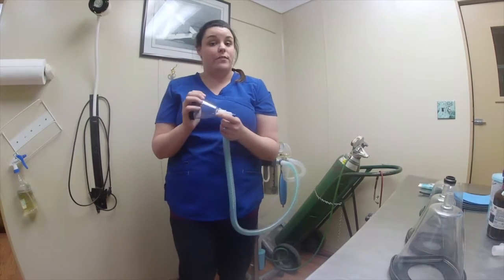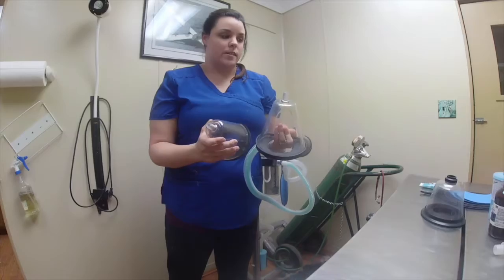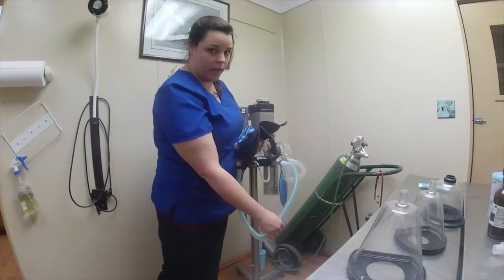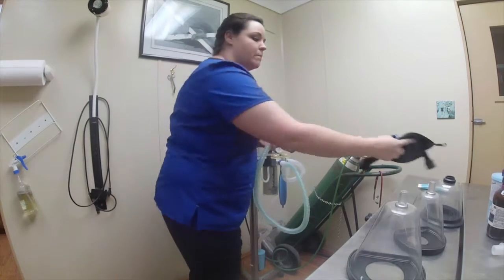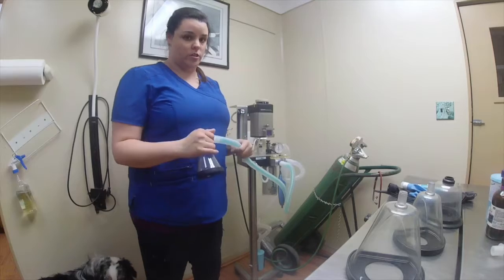This would be for very, very little patients. And then we can move up to big dogs and medium-sized dogs. And then you would change your bag and your tubing accordingly. For anything under 15 pounds, it needs to be this little tube. For anything over 15 pounds, you need a much larger tube.